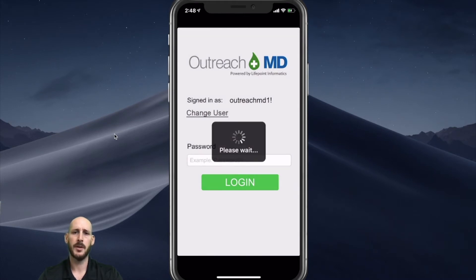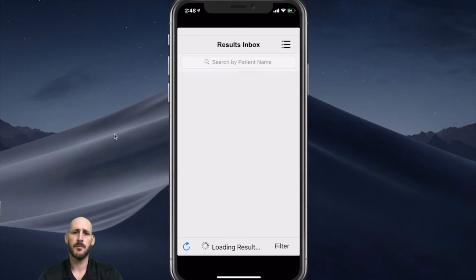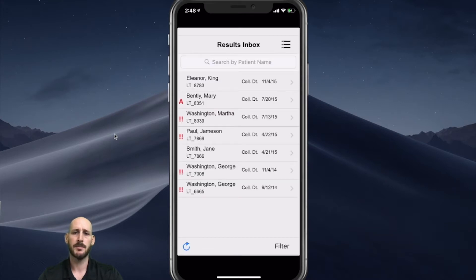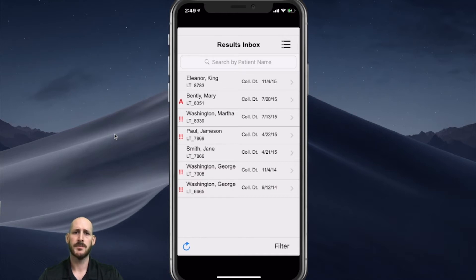The first screen that will open up once I am logged in is the results inbox. We're pulling down this information from LifePoint and displaying it within the application — only viewing or displaying information on the application and no data is being stored on the device. To view a report, I will just click on a particular patient, in this case Mary Bentley.